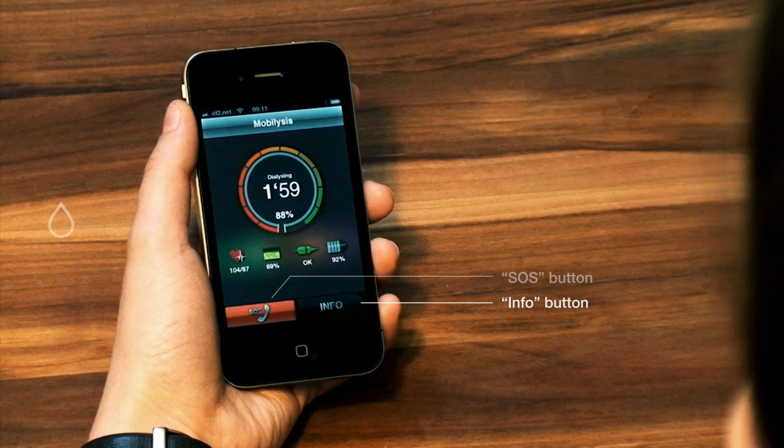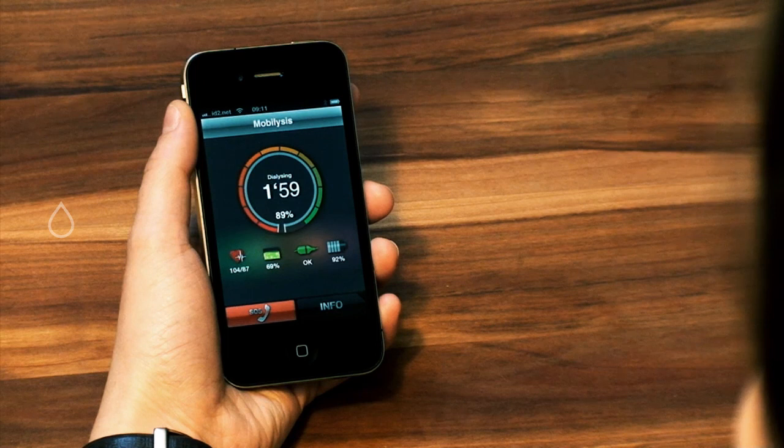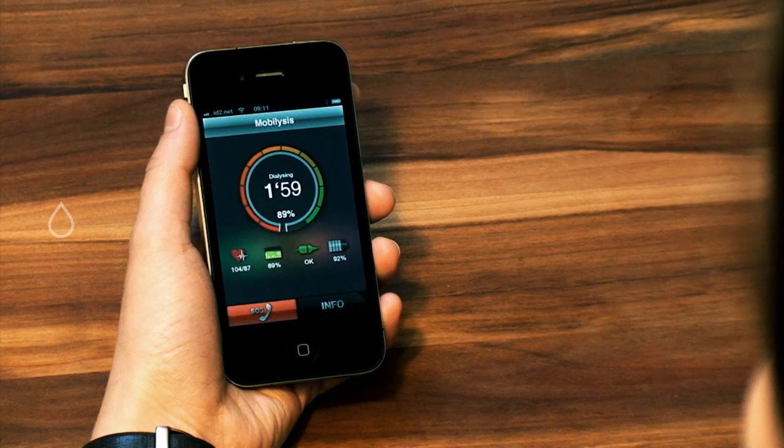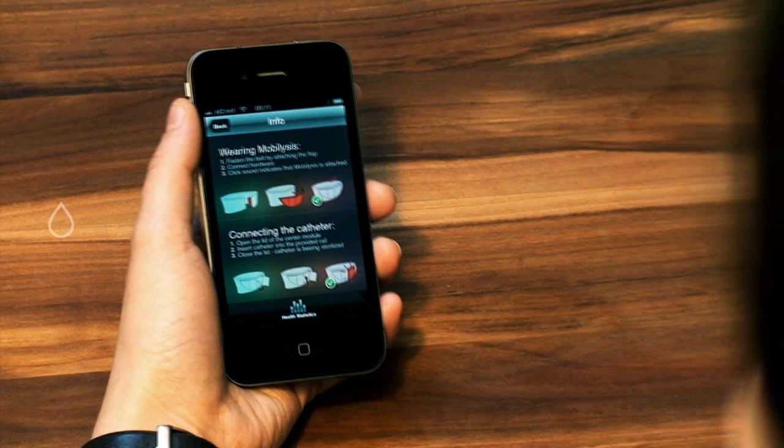At the bottom of the page, you see the SOS and the info buttons. By clicking on the SOS button, the patient issues an emergency call. The info button directs you to a quick guide to wearing and connecting the device.